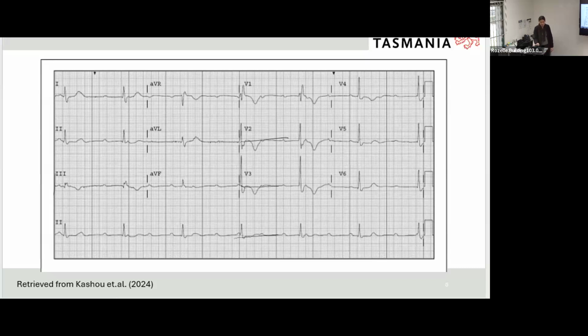Is anyone in disagreement about that? Is there a tolerance? For example, is one little block okay, or is it absolute when you're seeing if it's elevated or depressed? It's a good question, and we're definitely going to talk about it a little bit more when we're talking about ACS. But there are different thresholds for different populations and different groups.